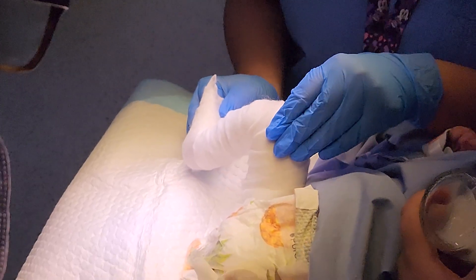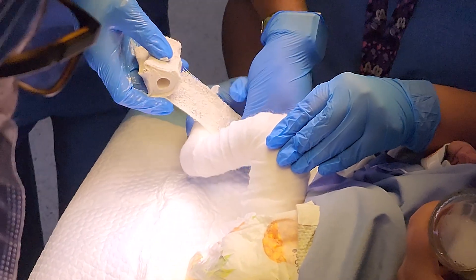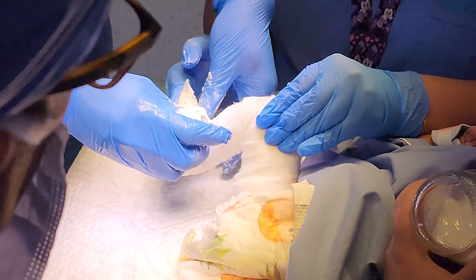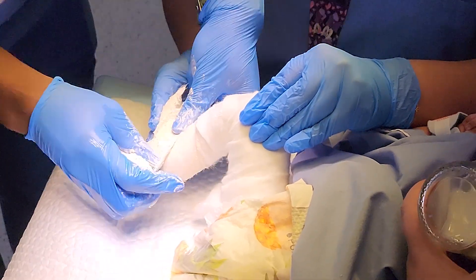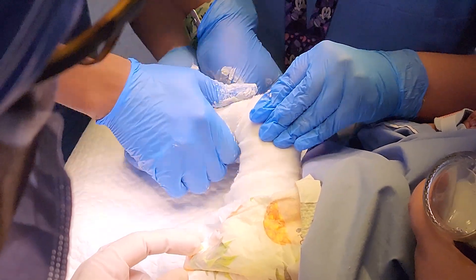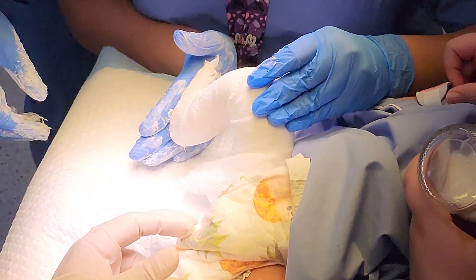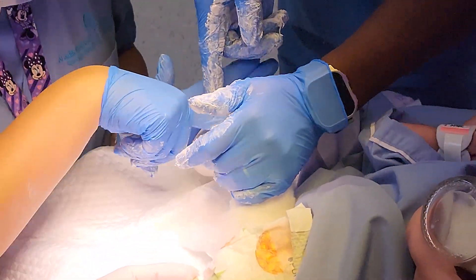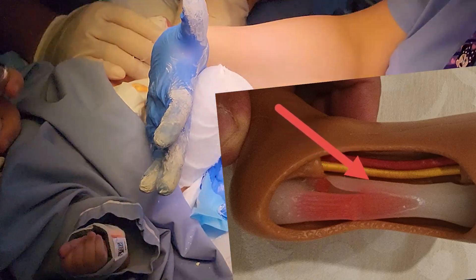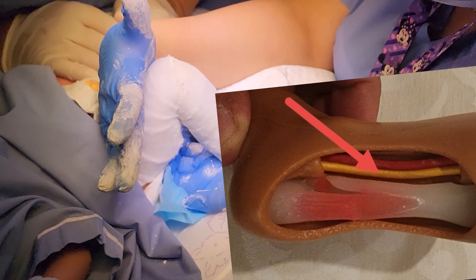While watching the cast application, there are some controversial exam questions to consider. Question one: what do you do in clinic? Some expert people do perform tenotomy in clinic, but I prefer theatre because I have more assistance, I feel less rushed, and the environment is cleaner. Some people use general anaesthesia — this is probably not necessary for younger children, but may become necessary as children grow older because their muscles are strong and they can kick and cause damage. As seen in this picture, the tendon is only around 3 to 4mm away from the neurovascular structures, so an unexpected kick could inadvertently injure these.